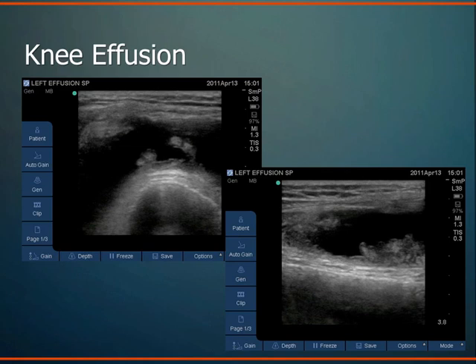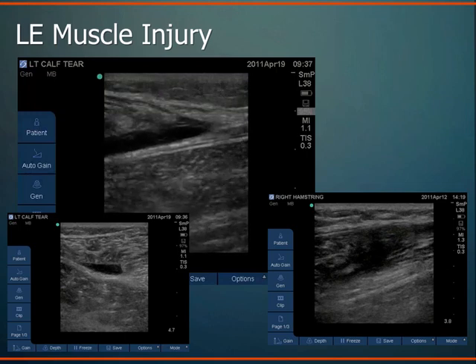This is an example, a patient I saw a couple weeks ago, joint effusion, just a classic presentation of knee arthritis, acute exacerbation, lots of pain, lots of swelling in the knee. This is that suprapatellar pouch of the joint space. The knee joint space extends pretty far above the knee in that suprapatellar pouch, and when you have a joint effusion, that area can be extended or distended. This is the fluid collection in there, all fluid with some joint debris floating around. This is just a chronic, classic osteoarthritis presentation, seen quite well. Long axis view, axial view. This is the femur right here, hyperechoic line. Incredibly common. I see these all the time in the emergency department.